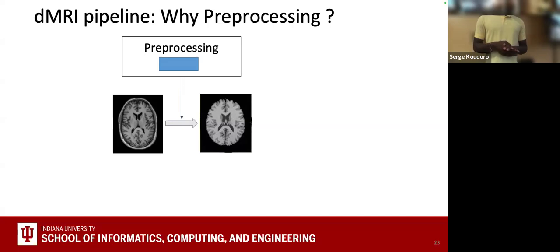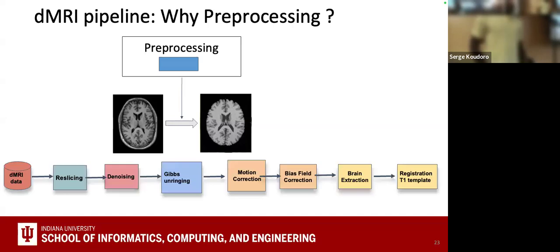And unfortunately, the MRI scanner brings a ton of artifacts during its acquisition. It's not a perfect technology, plus the different environment interacts, and that's why our data can be quite disturbed. So a pre-processing pipeline will be something like that in diffusion imaging. Again, this is a standard. But in all this pipeline of preprocessing, you have many steps that are optional, some that are mandatory, etc.